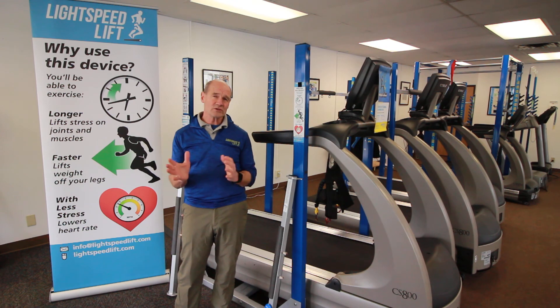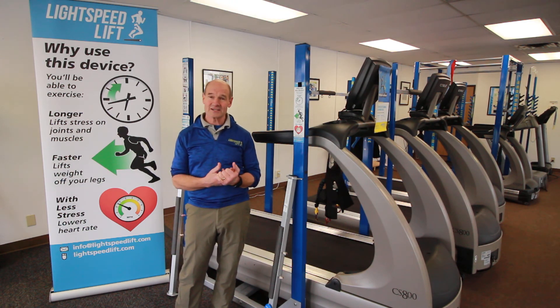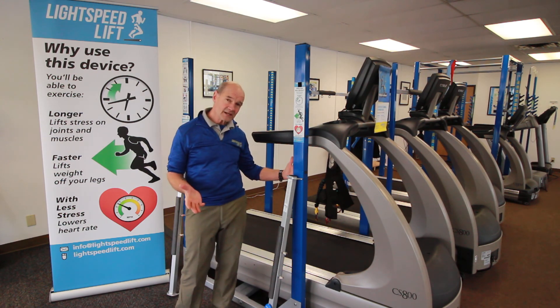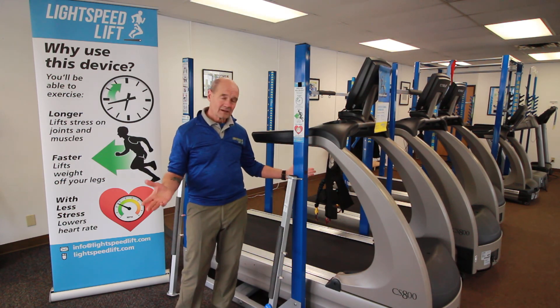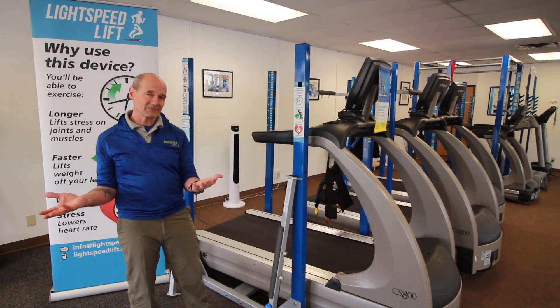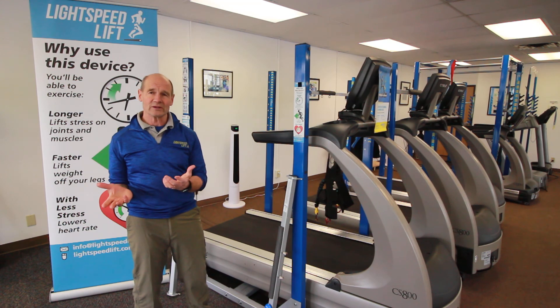I want to show you today how the Lightspeed Lift sets up around any treadmill. As you can see, we've got this frame set up around a regular professional grade treadmill, but it will fit around any treadmill.